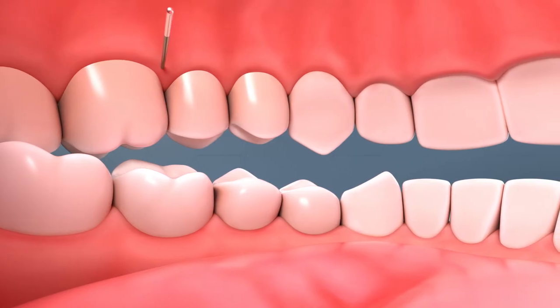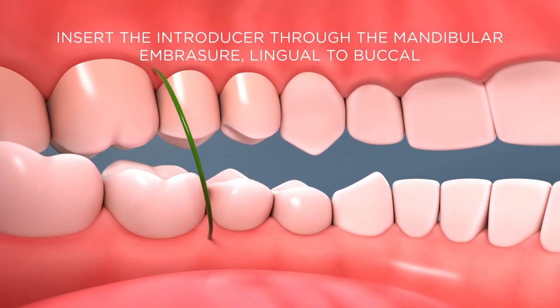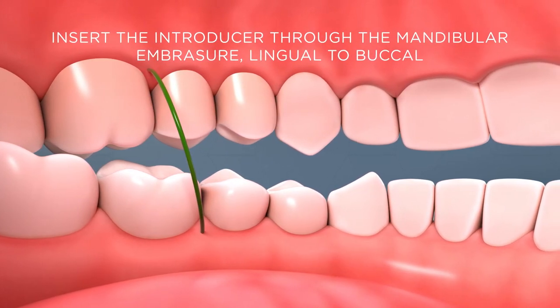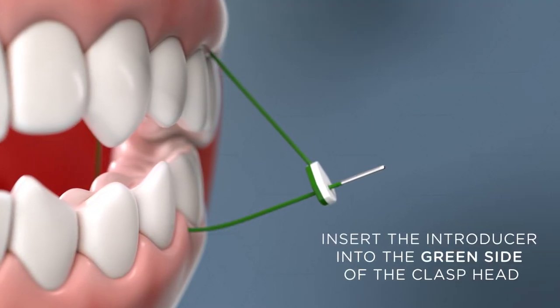After entering the maxillary embrasure from buccal to lingual, insert the introducer through the mandibular embrasure lingual to buccal. Then insert the introducer into the green side of the clasp head to form a loop.